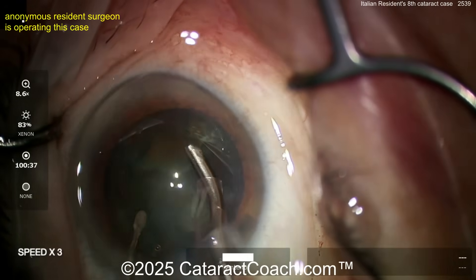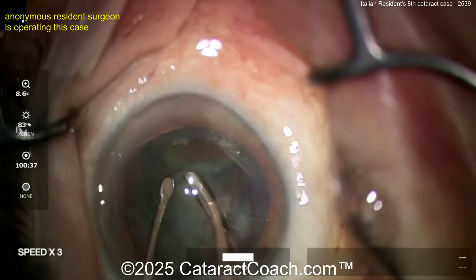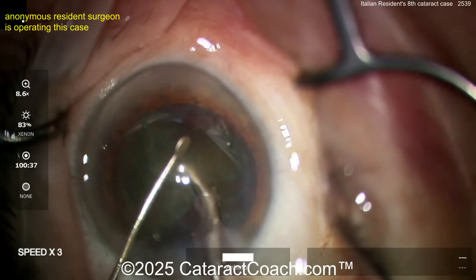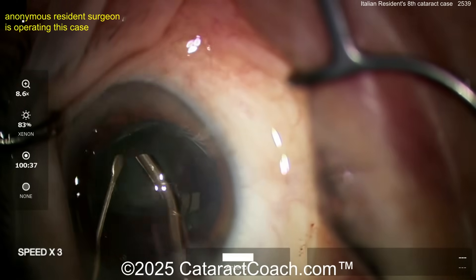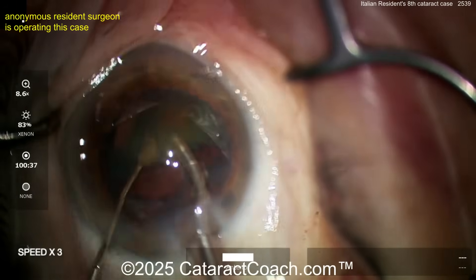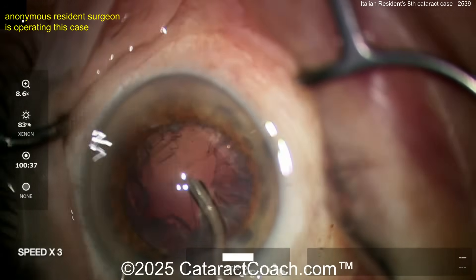See how the view is kind of dark here? It's because the eye is not in primary. I do believe it's case number eight — you've obviously watched a ton of videos and learned a lot. But I want to give you a challenge: my challenge for you is next time you do a case, keep the eye in primary. Why is the eye up there near the upper lid? I want this centered up here — keep the eye in primary.